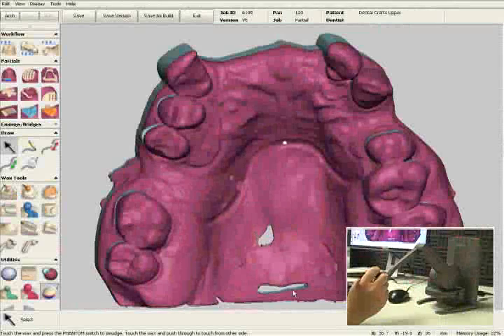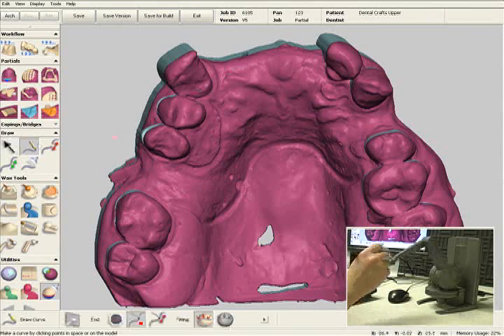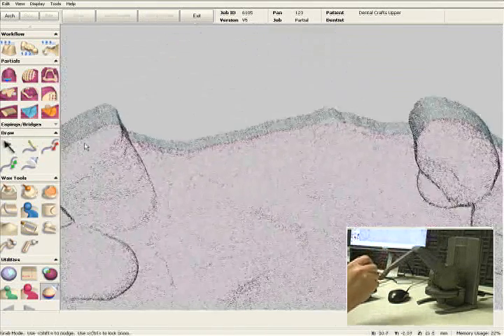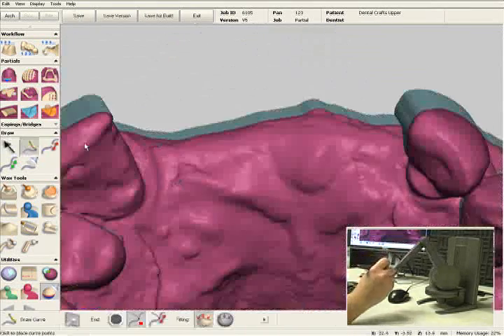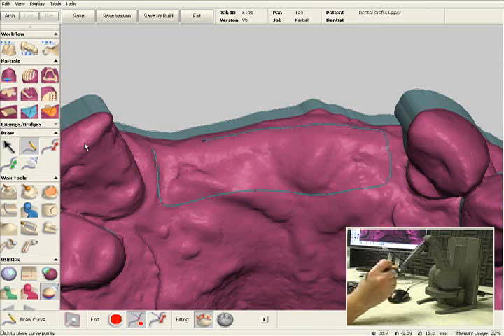Now we'll design the mesh area. With the sensible dental lab system, you can design and wax the mesh area at the same time. I'm going to select the pencil tool, and I'm going to zoom in onto the tissue area. I can actually feel this tissue area as I'm plotting these points. What I'm doing right now is I'm outlining where the mesh and the relief wax are going to be.